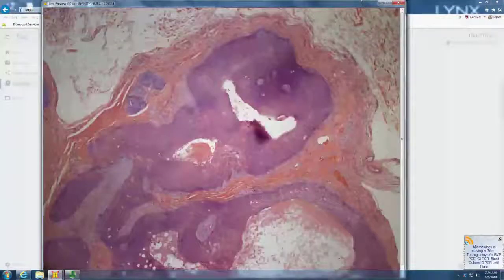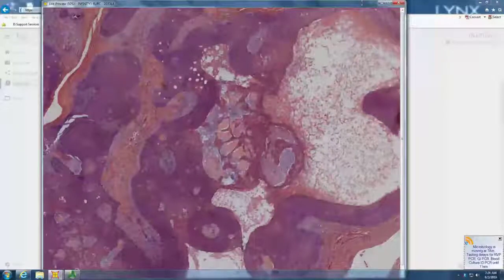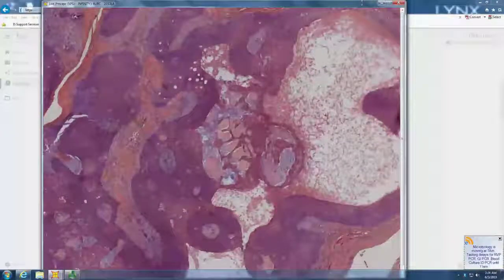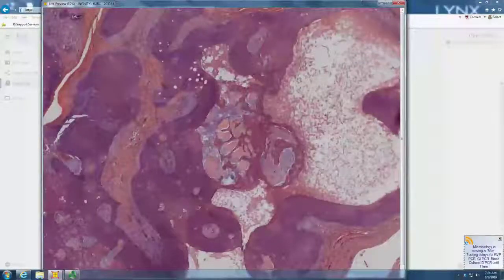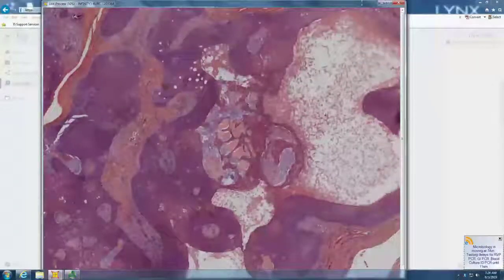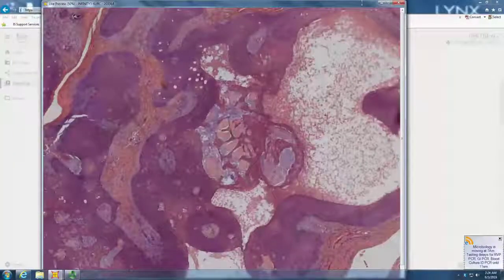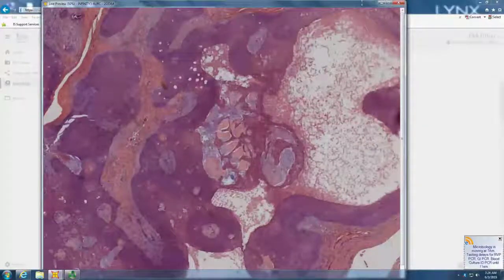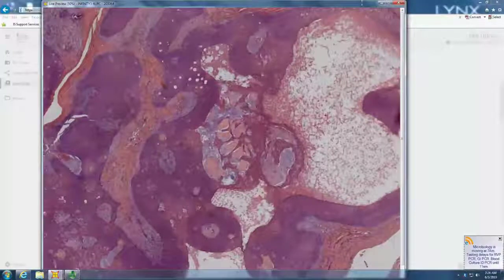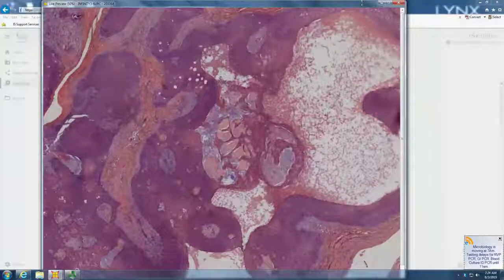Yeah, like a poroma. That's poroma stroma, the osteoid-like stroma, which is a million wraps of basement membrane zone around a vessel, creating that osteoid-like stroma. So poroma, acrospiroma, hydradenoma, they're all the same, right? So poroma, acrospiroma, hydradenoma, all the same family of tumors.